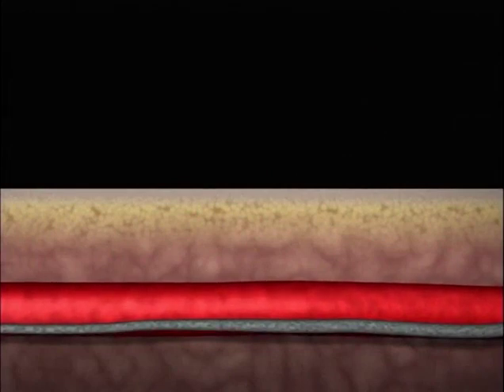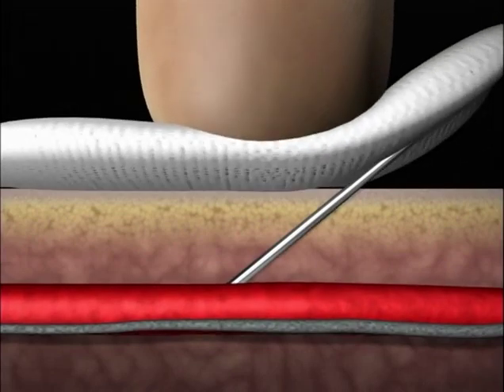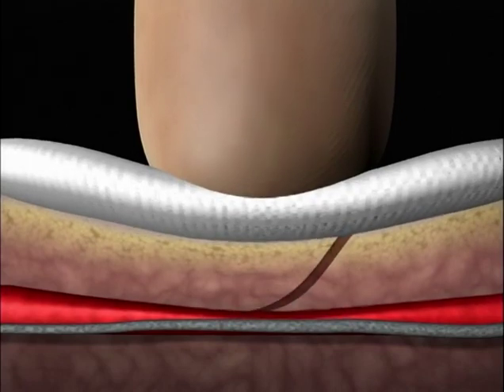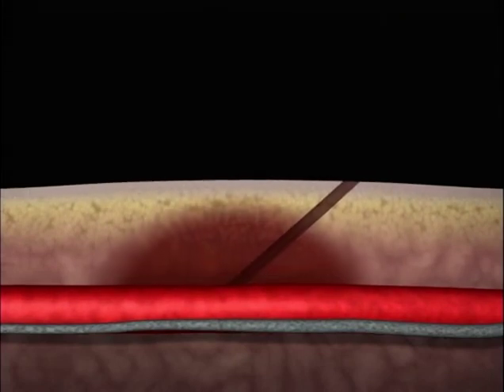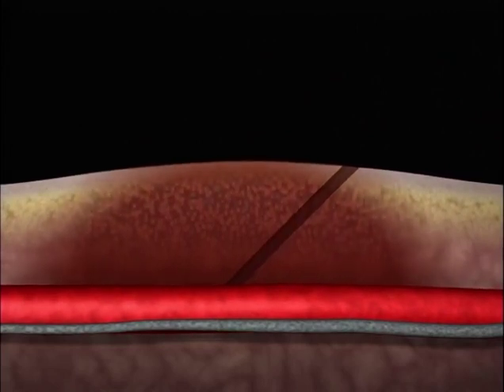Hematomas exert pressure on delicate nerve tissues and can lead to long-term complications. Always apply firm pressure to the area for a minimum of 3 to 5 minutes for radial punctures after the needle is withdrawn, and 5 minutes for brachial and femoral punctures. Then release pressure and carefully observe the site for skin discoloration or a raising or mounding of the tissue, which indicates hematoma formation.